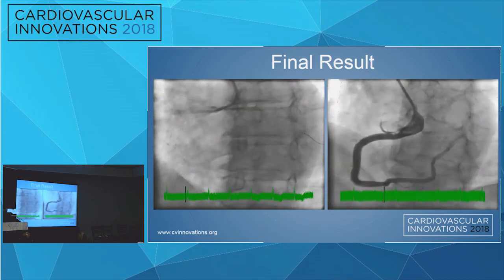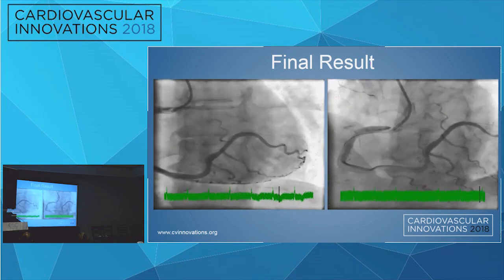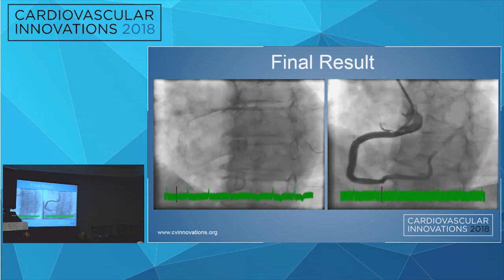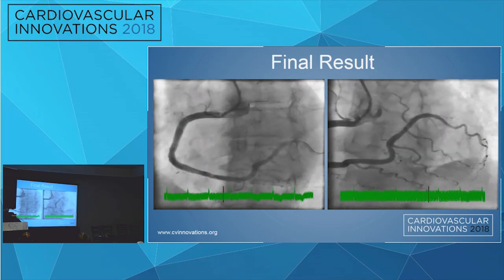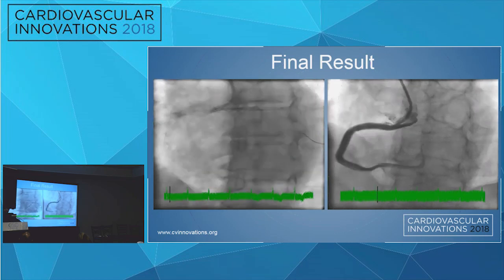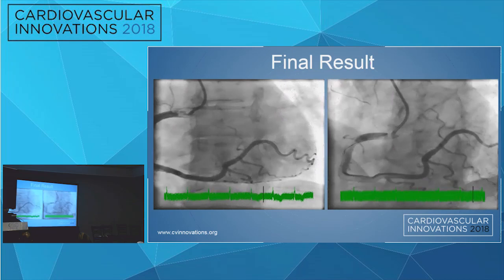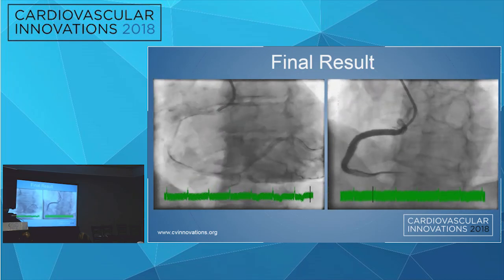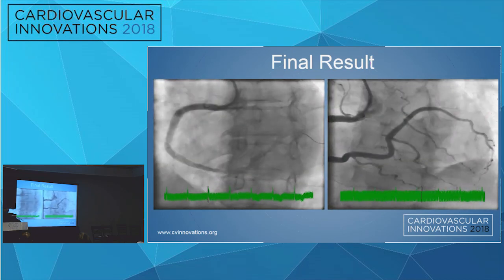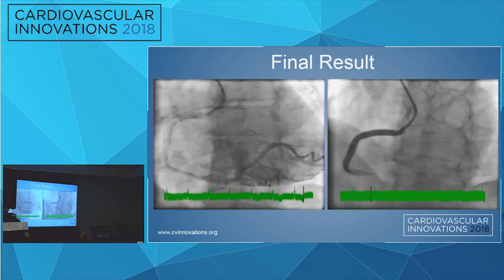I chose not to image in this case. I really thought about it. I thought, let me just do a quick IVUS down this vessel, make sure that the stents look good, and that, more importantly, the stents are accurately overlapped. But I felt comfortable with where I placed the stents. I think if I could go back and do it again, I probably would have tried to image not only on the front end to confirm what these dissections indeed were, but also perhaps at the conclusion of the case. But I didn't do that.